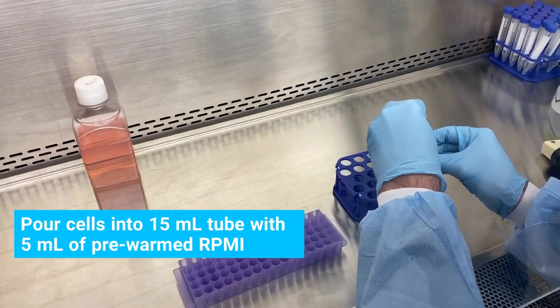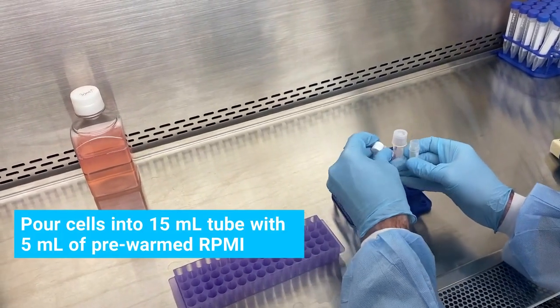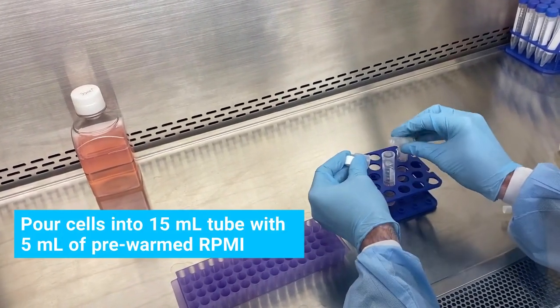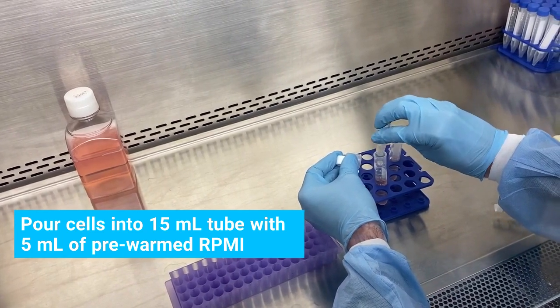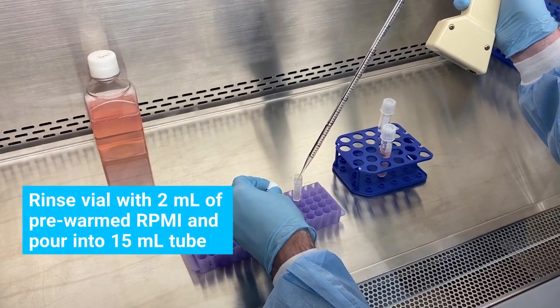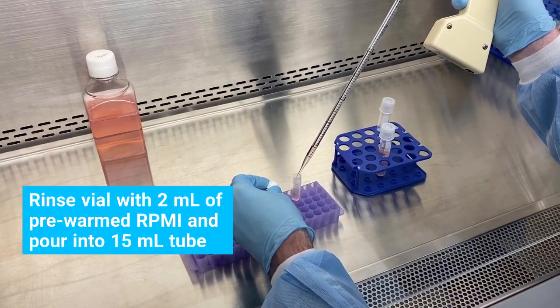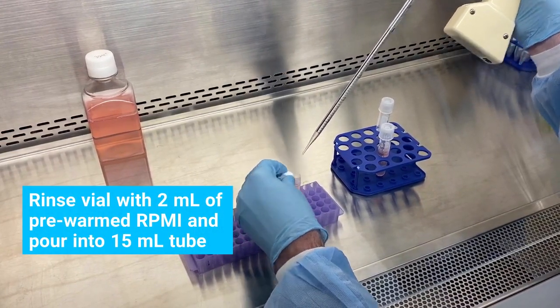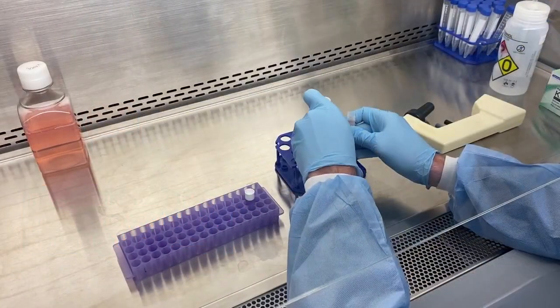Pour thawed cells into a 15-milliliter tube with 5 milliliters of RPMI that has been pre-warmed to 37 degrees Celsius. Rinse the vial with 2 milliliters of RPMI and pour into the 15-milliliter tube to recover the remaining cells.